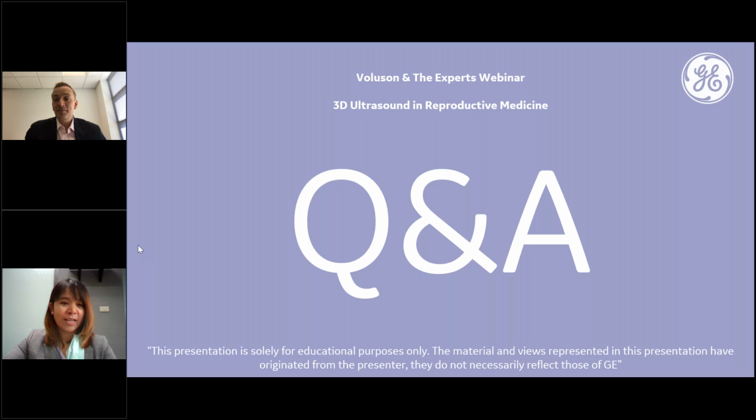Okay, thank you. And then the question is, do you measure and count all of them if we have the fibroids, 10 plus? Yes, I saw that's a question for Mario. It's a really good question.